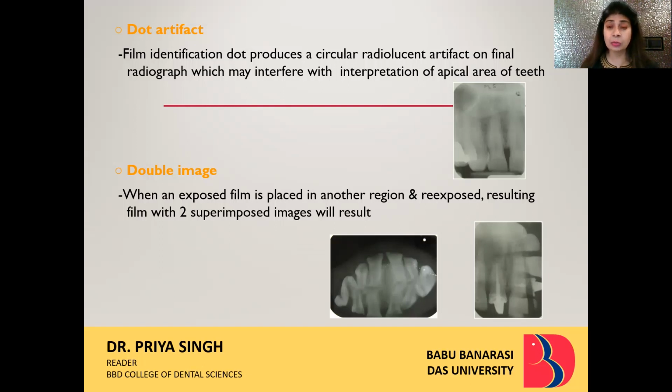At times, it might interfere with the apical area of teeth. If you don't know where this particular dot has to be placed, at times at the periapical region, it might lead to the impression of a pathology, or maybe an anatomical landmark being superimposed in the region. So it should be placed adequately.